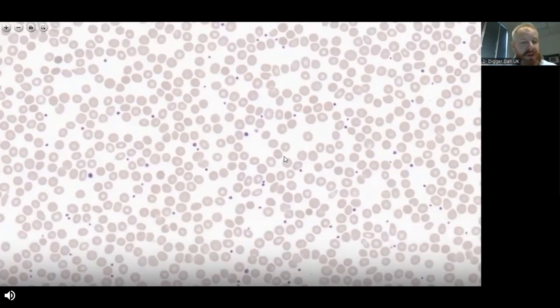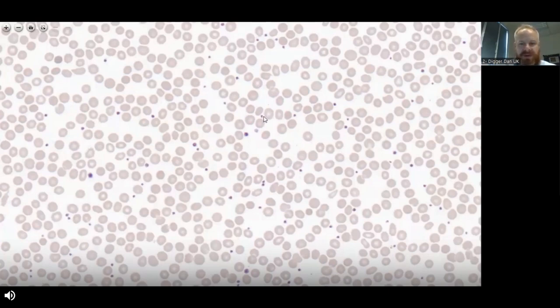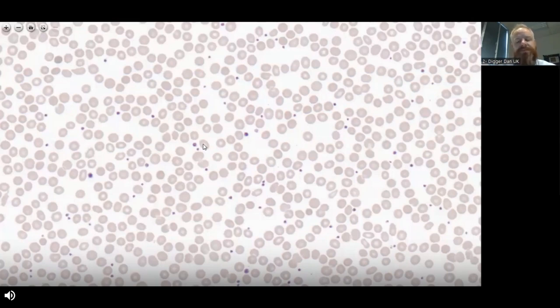As we zoom in on this blood film, we can see that these are in fact purple-colored platelets. Platelets are one of the cellular components of blood. Platelets usually are about one to three micrometers in diameter. If we look at the size of these compared with the red cells on this blood film from a normal healthy person, they're about a quarter to a third of the diameter of most of the red cells.